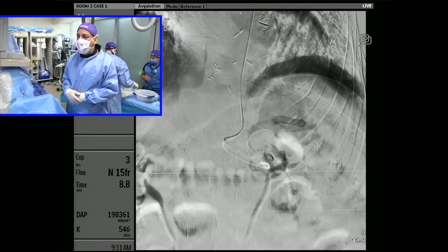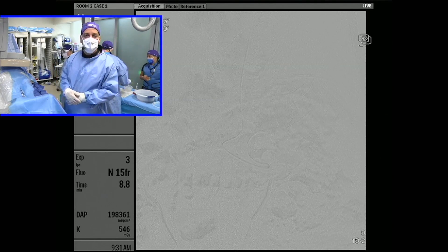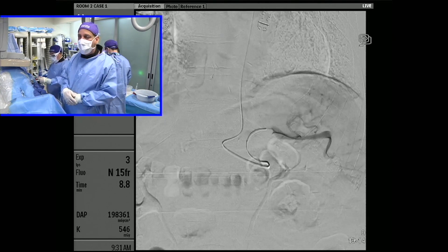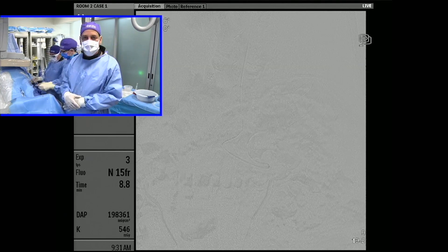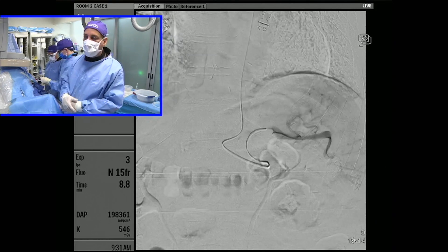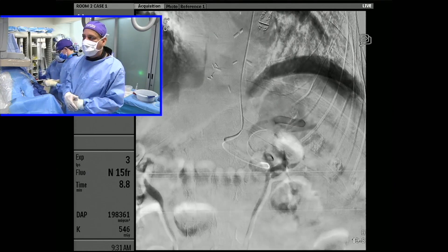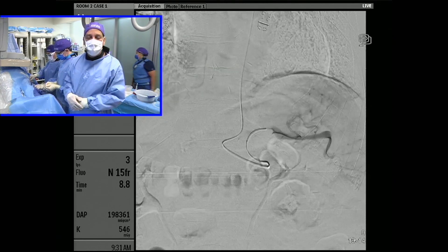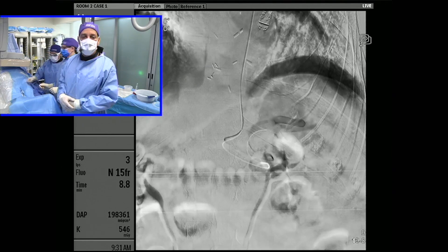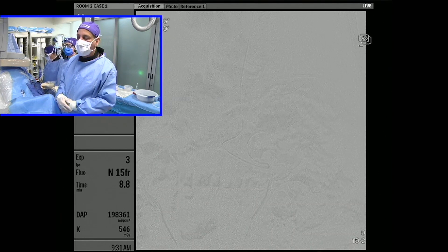As many of these do, it has progressed about one to two millimeters a year for the last four to five years. It's now easily 2.6 centimeters in the long axis, close to three centimeters in size. So there's been objective growth of this, and the patient is well recovered and very functional after his open dissecting thoracic repair.